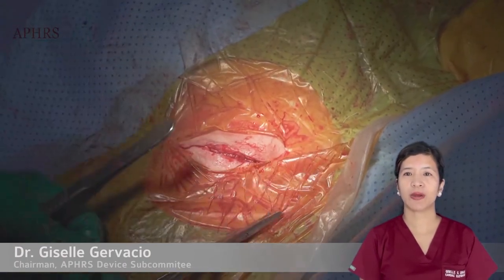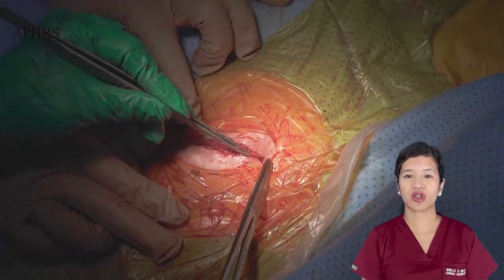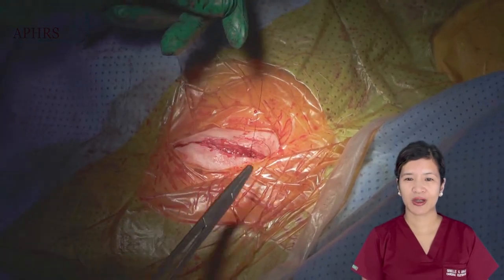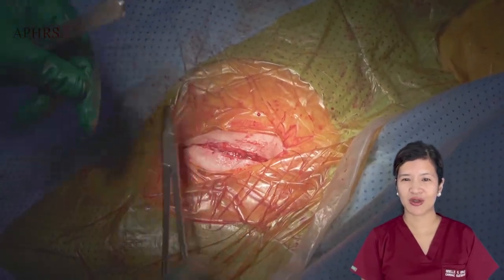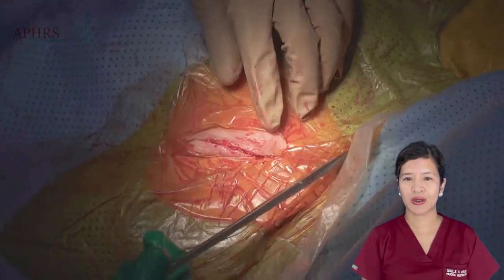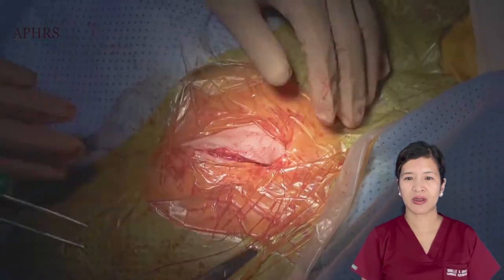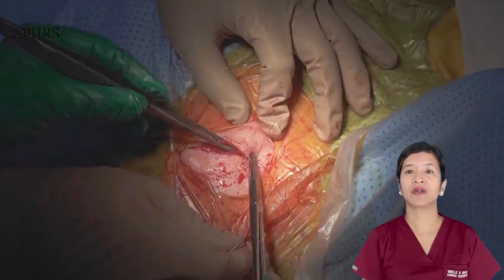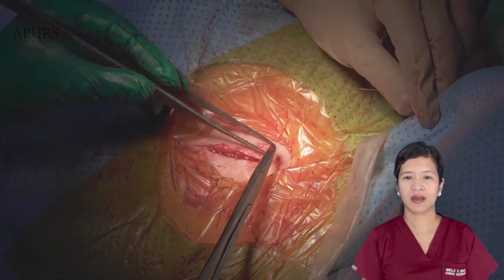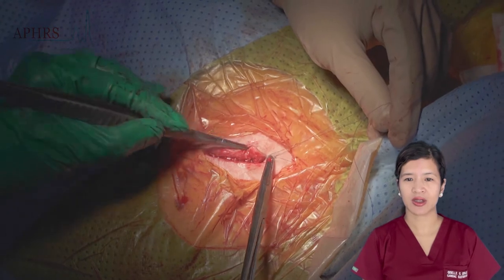One challenge with replacements is that the presence of fibrosis and scar tissue may make suturing difficult, and you can see in this portion of the clip that there is some resistance to delivering the suture. When suturing, we also want to always take advantage of the angle of the needle to avoid bending or breaking it, and then once again we cut off the excess suture.